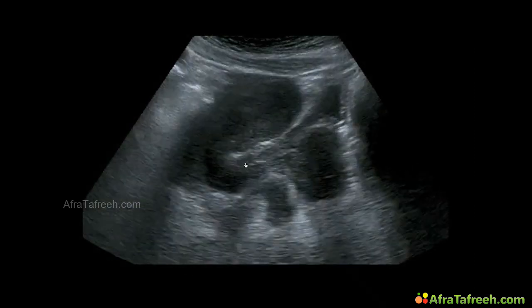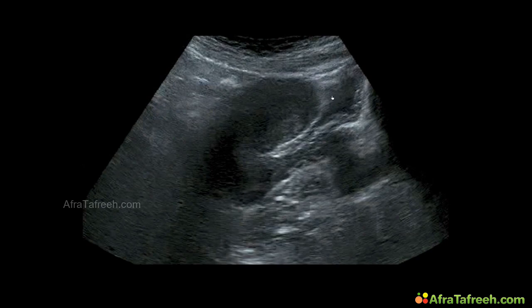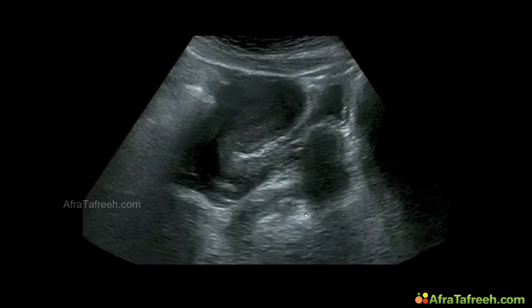On the screen, we see now a longitudinal scan of the uterus. Over here, body of the uterus, fundus and cervix. In this case, the bladder is empty and it's not so easy to detect the vagina over here and cervix over here. Once again, when the bladder is empty, it's not so easy to detect the structures, but we can nicely see the fundus of the uterus, the body and the cervix over here.